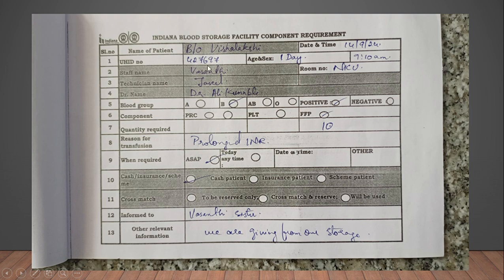You mention which staff from that particular ward or room is informing you, and you also enter your name. Who is the primary doctor asking for that component is also entered. What blood group and what RH they require, and what component they are asking for, whether packed cells, platelets, fresh frozen plasma or cryoprecipitate, whatever it is, you note down how many quantities they require.